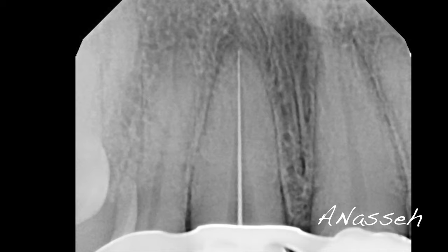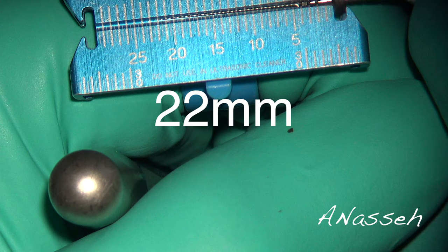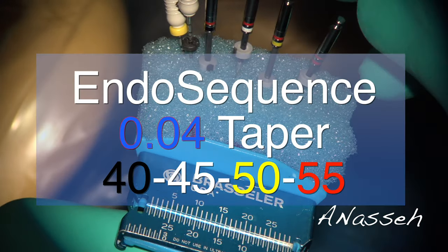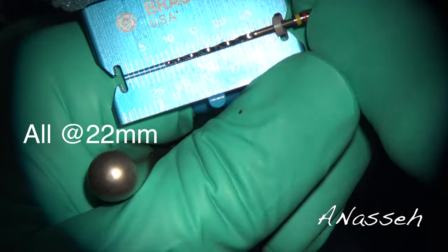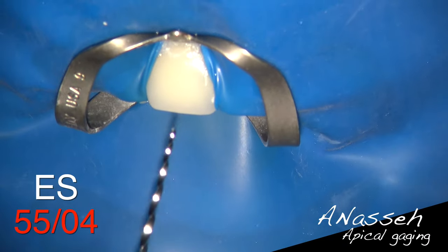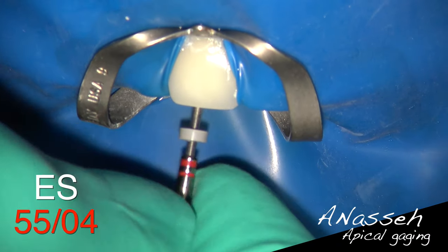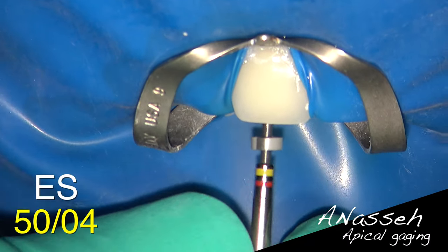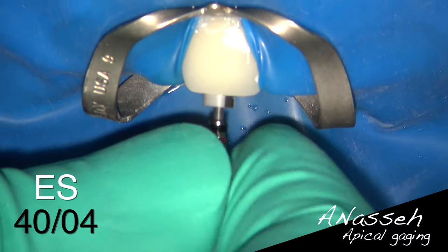I'm using a protocol with a series of 04-taper instruments, validating the working length at 22 millimeters. Using EndoSequence 04-taper sizes 40 through 55 for gauging these larger apical diameters, I start from the largest: the size 55 is about three to four millimeters short of working length, the 50 is about two to three millimeters short, the 45 is about one millimeter short, and the 40 goes to the full working length — all without any instrumentation. I've now gauged the apical area and know exactly what's going on.